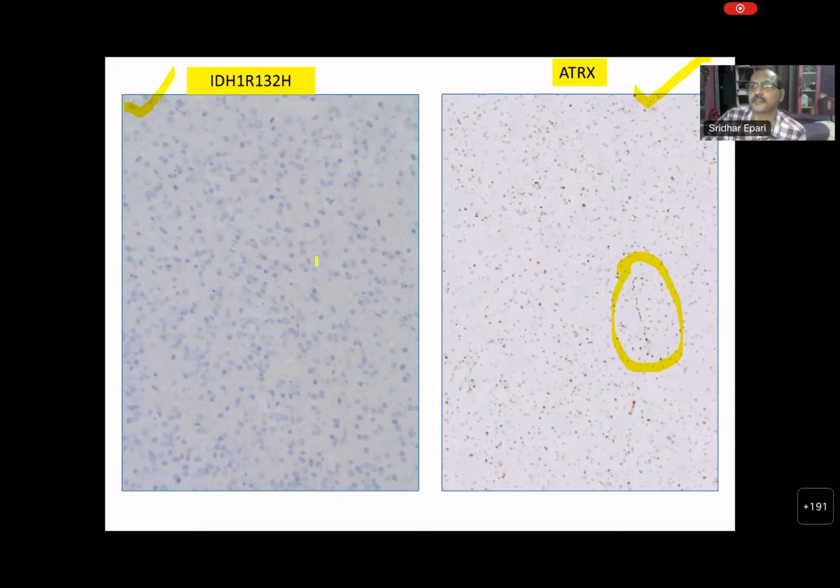You saw the first 2 cases of IDH mutant astrocytoma. Both the cases had ATRX loss. Okay? And this pattern coming in excludes the first subset. Astrocytoma IDH mutant, it cannot be. It can still be an oligo, it can still be a glioblastoma IDH wild type too. Is it right? Any doubts on this? So now at this point, what do you want to do?